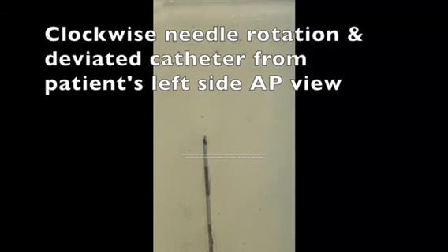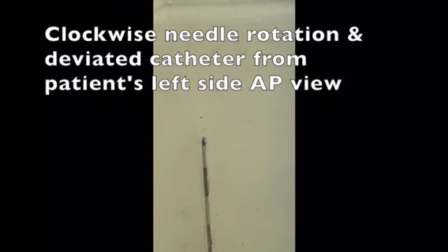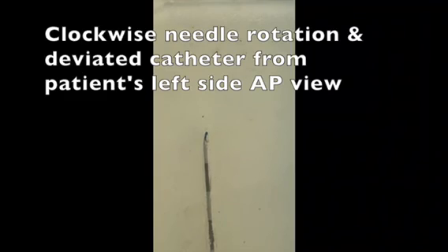The third scenario is when I advance the catheter, the patient will report, I feel the pressure on the left side of the back. So I will take the catheter back into the needle and rotate slightly clockwise toward the patient's right side, and then re-advance the catheter until the patient reports the pressure again.